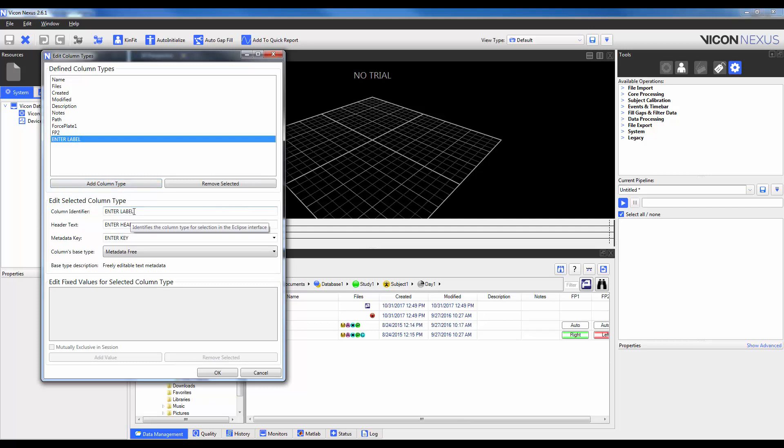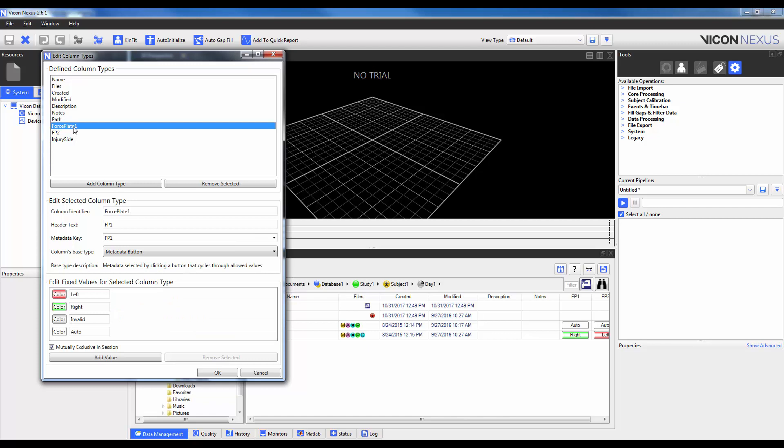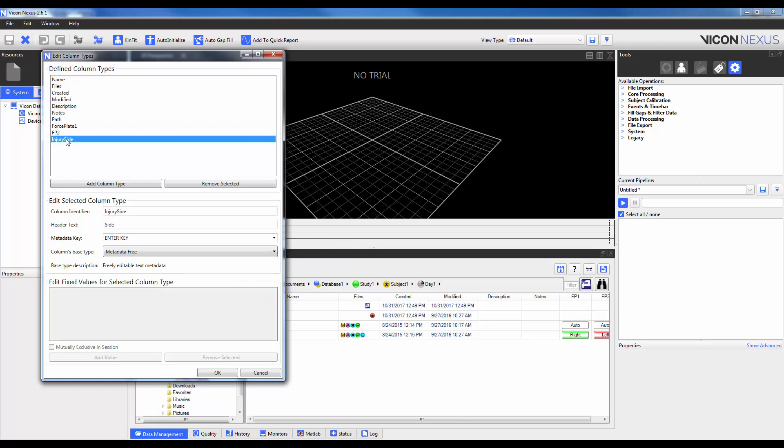I'm going to enter in an identifier and the header text. So the identifier is what's going to be used when we right-click to identify that Column Type. So I'm going to type in Injury Side here. And then the header text will actually be what is displayed at the top. So I'm just going to type in Side. Just as an example, you can see here for Force Plate 1, when I right-clicked earlier, I identified that column type with Force Plate 1, but the actual text itself in the header is FP1. So that's going to be something similar here for Injury Side.